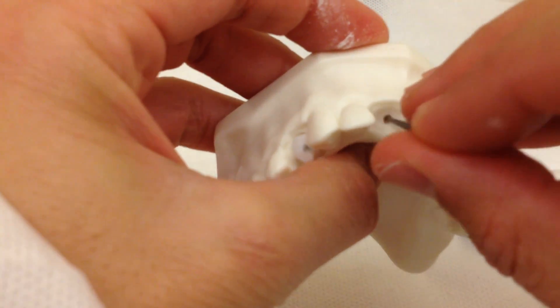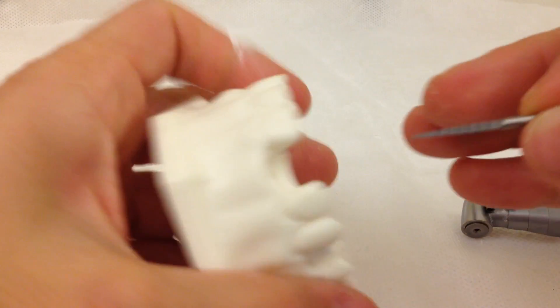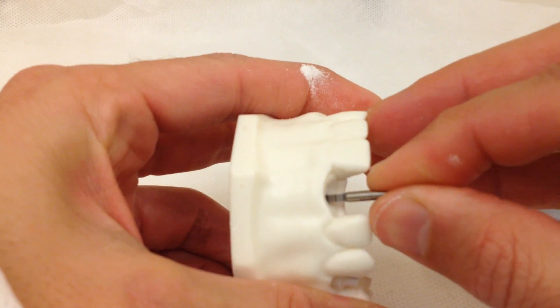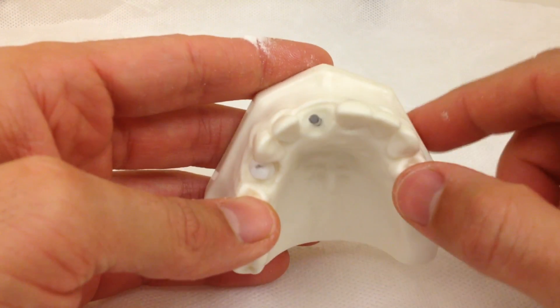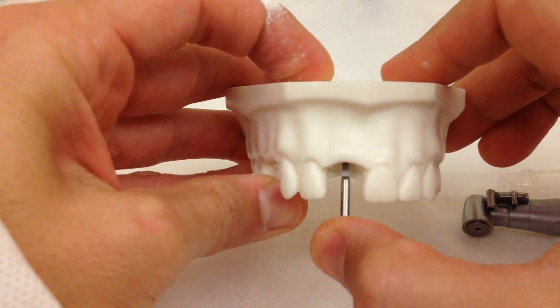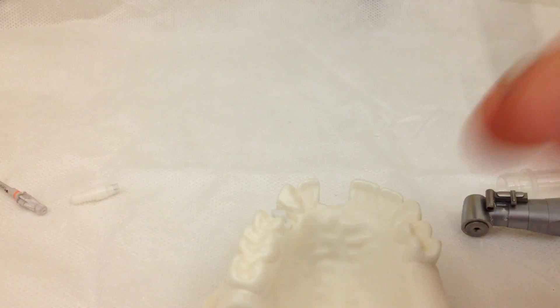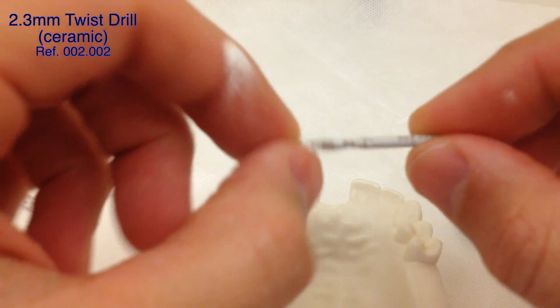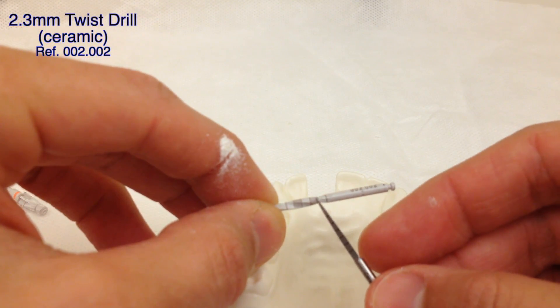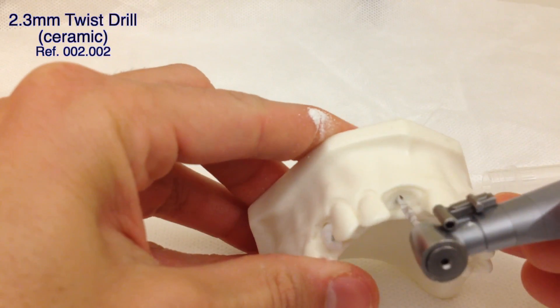Right now I believe we have reached the 14 millimeter line. Yes, the 14 millimeter line is already buried and the direction of the drilling is following the incisal edge of the other teeth. I believe we can push the drill just slightly more to the mesial, but it's pretty much in the center of the socket. After the initial drill we're going to go to the next drill — this is 2.3 millimeters and the same length. We're going to put the drill and follow the incisal edge.